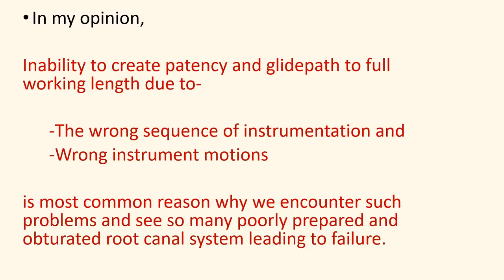Friends, in this presentation, I will try to simplify the steps in the glide path preparation, the proper sequence of instrumentation, and the step-by-step technique of glide path preparation within my limits of knowledge and experience.